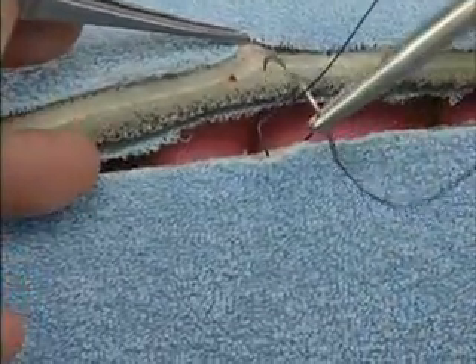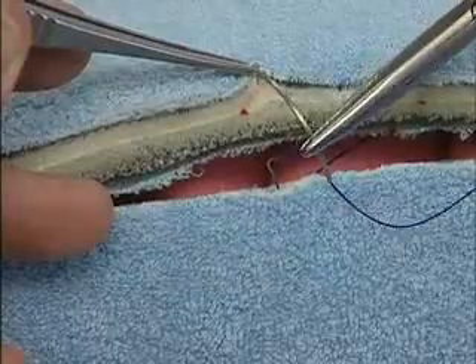Then on the side opposite the surgeon, the needle is passed from superficial to deep.